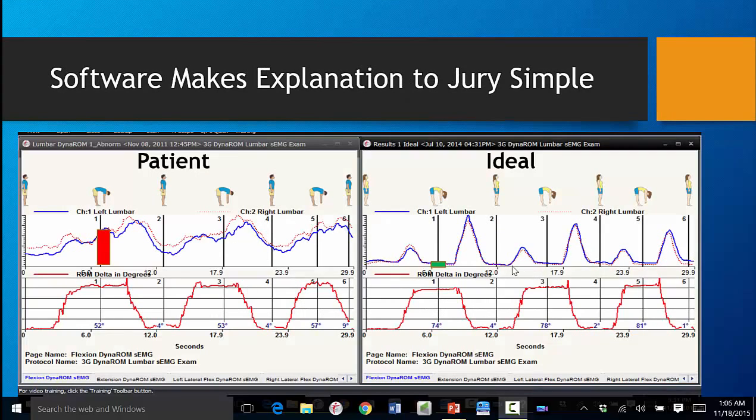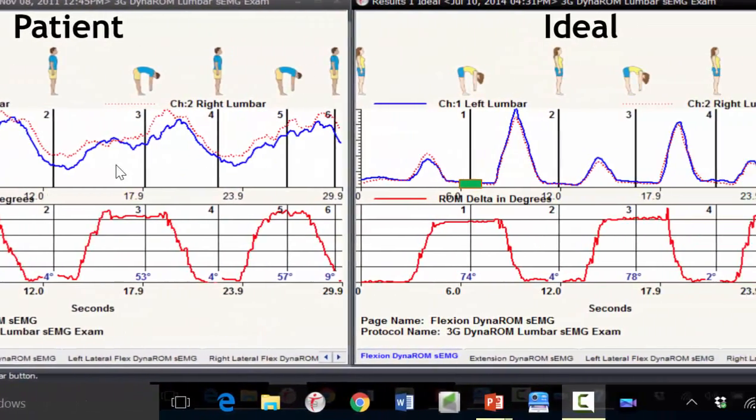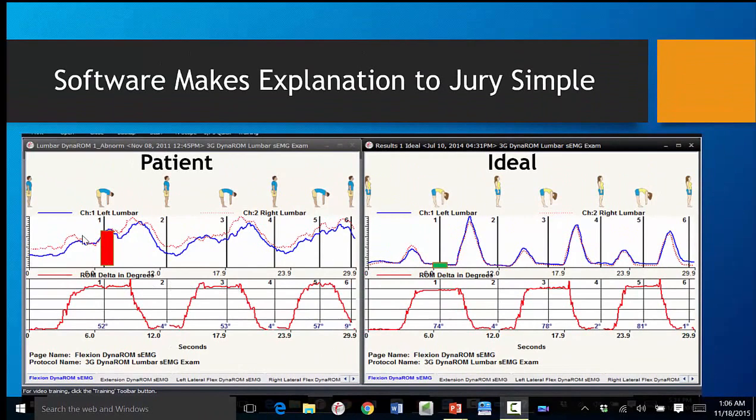We made this software so easy to use that you can actually use it in the courtroom. The software brings up the patient on the left and the ideal on the right, so you can show the jury very clearly what an ideal looks like and what the actual patient looks like, making it clear that there's an injury if there is.